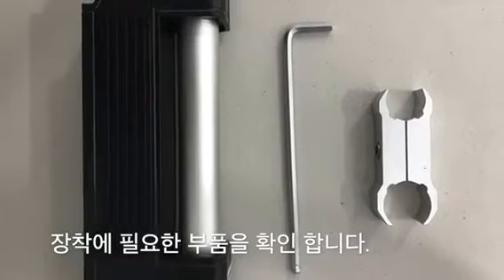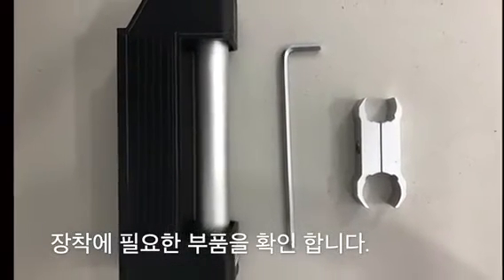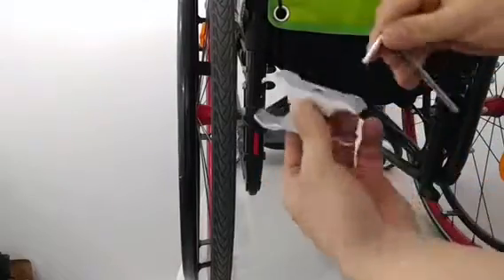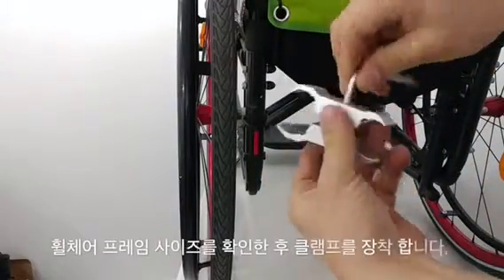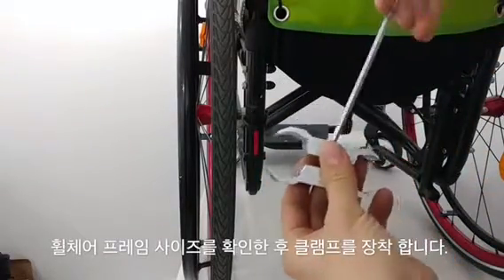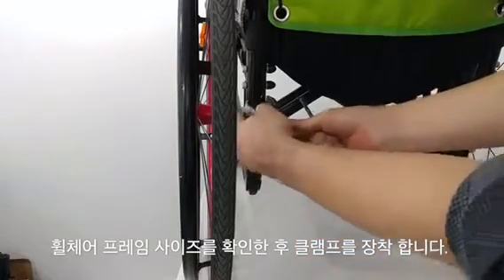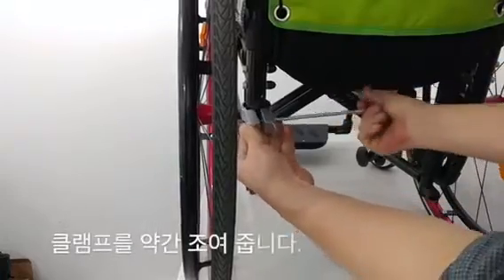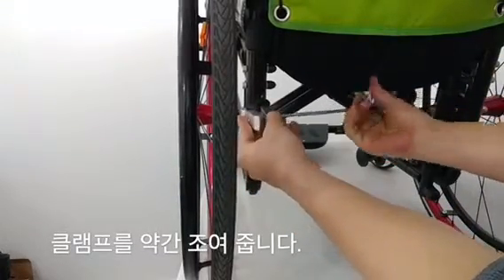Check the necessary components to install. Once checking the wheelchair's frame size, fit the clamping and tighten the clamp slightly.